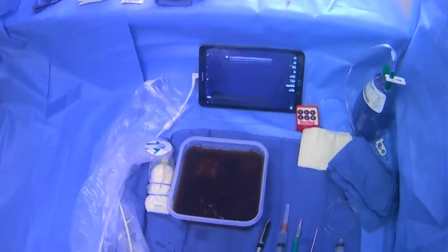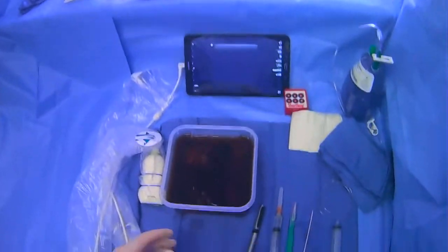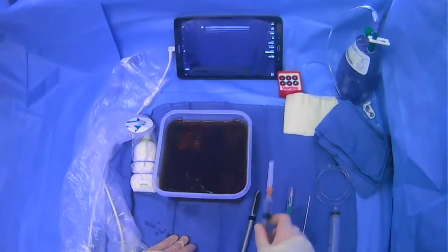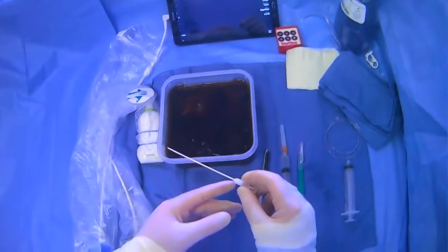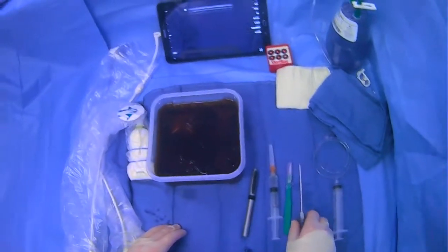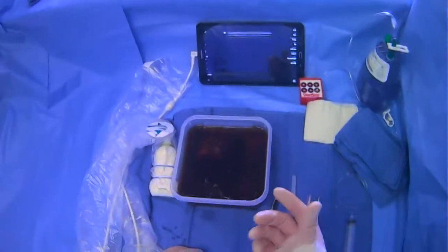Then you have a few options. You'll want to numb up deeper into the track you're going to take to actually drain the ascites. All of these options can be done with or without real-time ultrasound guidance. You can use the 25-gauge lidocaine needle to numb up as deep as you can go. Then you can switch to something like a UE needle — this is a 19-gauge, 5 French, 10-centimeter length UE needle that we very commonly use. There are straight and curved varieties; this is a curved variety where, when you take off the stylet, it will curve into a pigtail to keep it secure in place. Or if you want, you can hook up your lidocaine directly to the UE needle and give lidocaine with it as you go deeper.